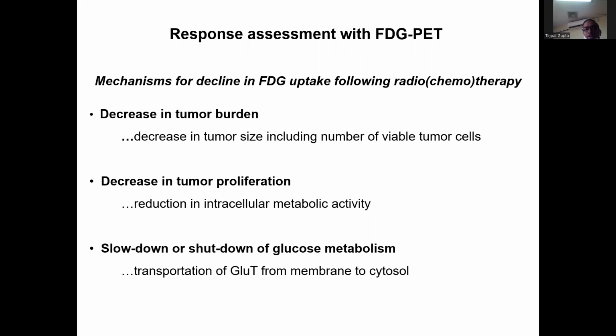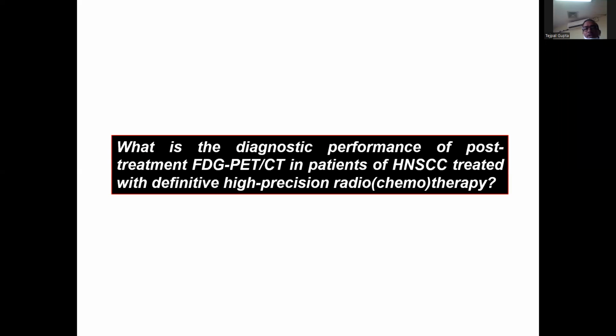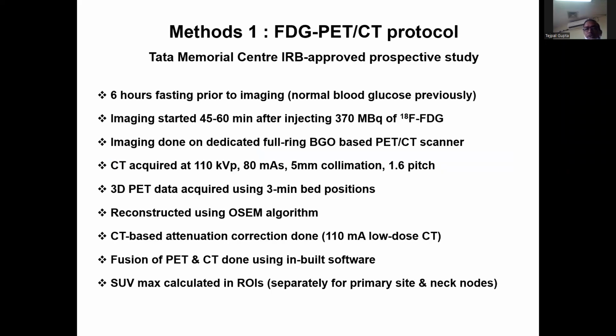So that is why the metabolic activity or the glucose metabolism significantly reduces following definitive radiochemotherapy, and that can be assessed quite nicely with the FDG PET following definitive radiotherapy. So we asked this question quite early on, in the early 2000s: what is the diagnostic performance of post-treatment FDG PET in patients with head and neck cancers treated with definitive high precision radiochemotherapy?